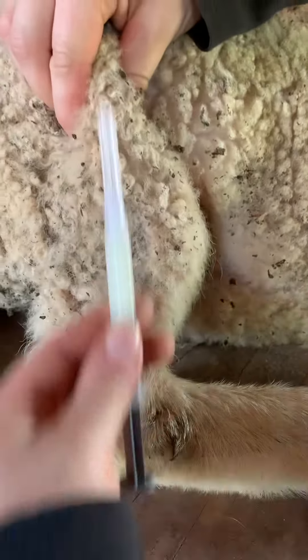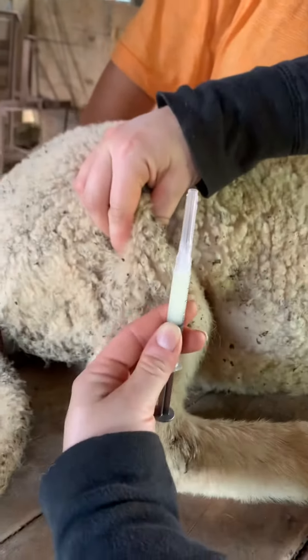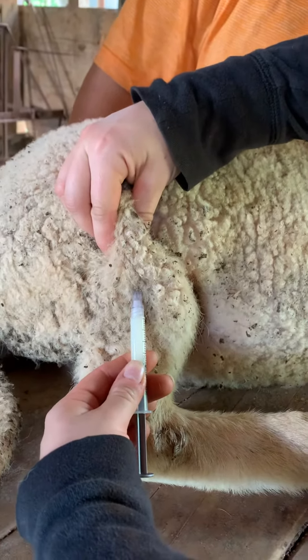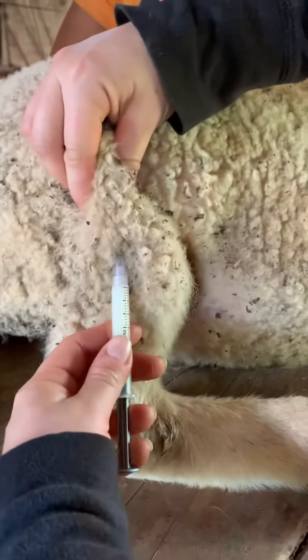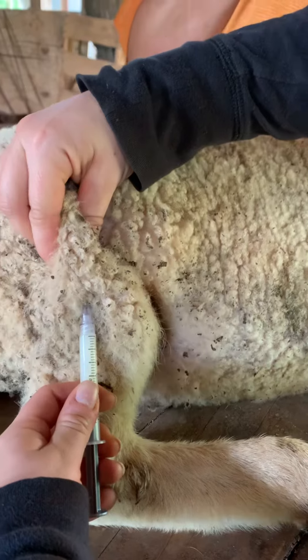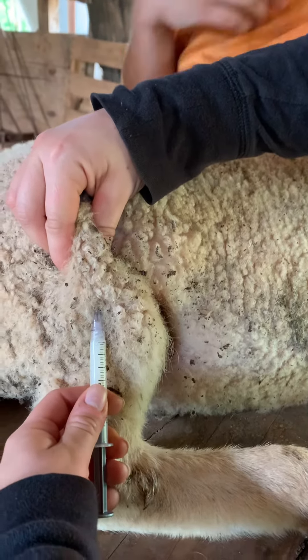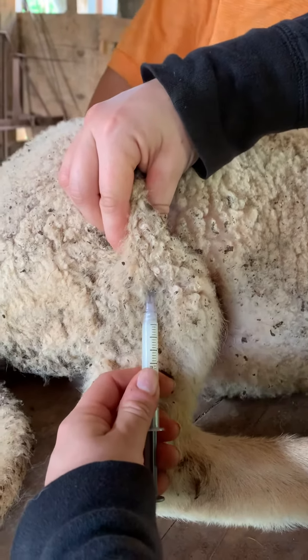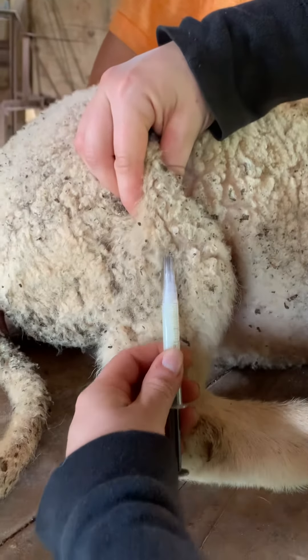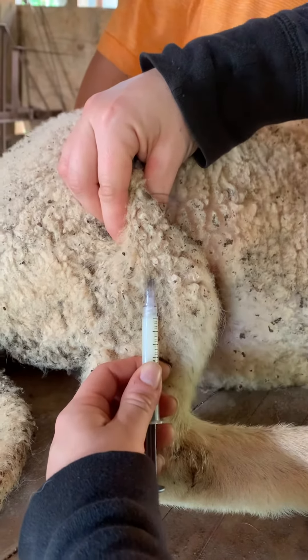You don't want to go in too deep. You want to go right in the open part of the tent, just in the loose area there. When you aspirate, you want to make sure it's free coming in and out. You want to make sure you haven't let the needle go all the way through the skin where it comes out the other side — just underneath — and that's a good way to do it.